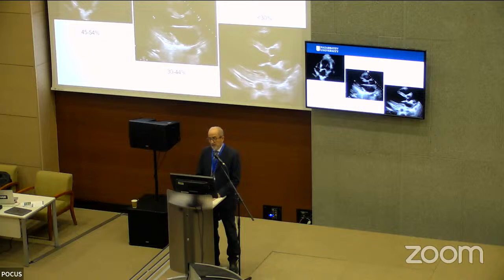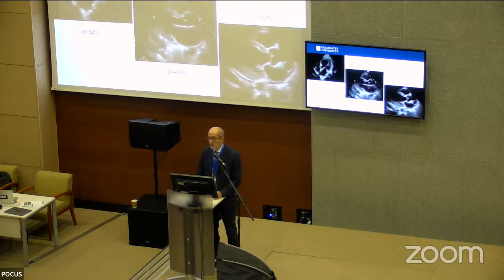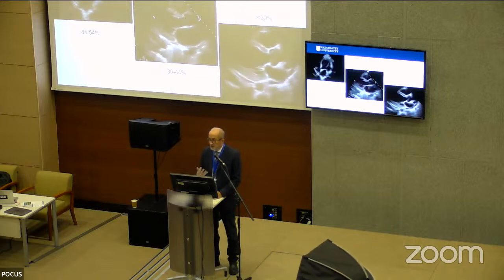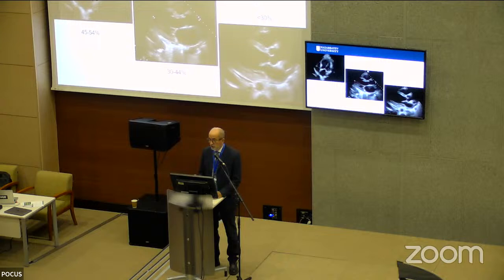Then when we move into a bad left ventricle, an abnormal left ventricle, we may have the difference between mild, moderate, and severe LV dysfunction, again according to the visual assessment of the wall motion and of the global left ventricular contraction.